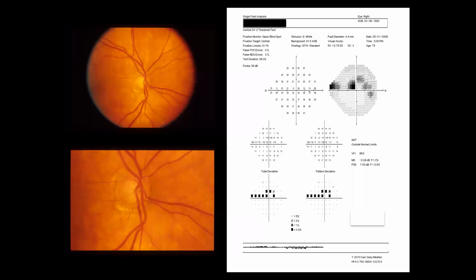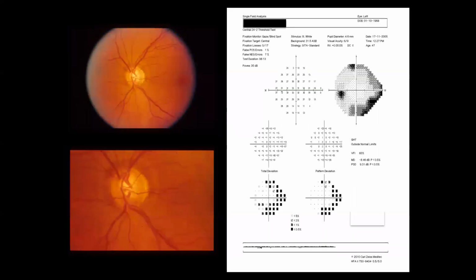So after that, what would you like to do? So you will evaluate for compatible disease, and that's of course a localized superior visual field defect that comes with glaucoma, because of focal optic nerve head damage. Then you will revise again and make sure that the data that you have given us are correct. Thank you very much, Khalid.